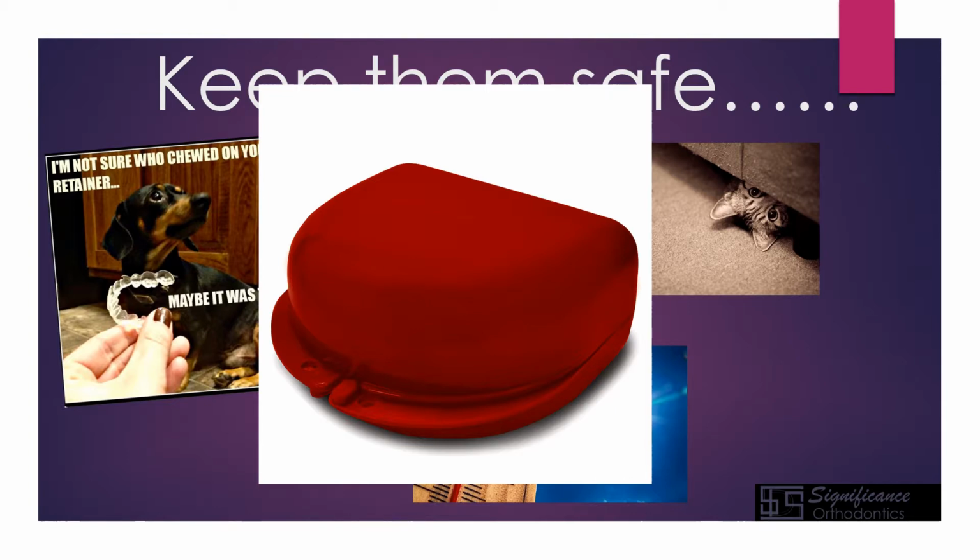That's where they go. So if they're not in your mouth, they're going to be in the case. Do not wrap them in a napkin, throw them in a backpack, or throw them in your purse. They will be gone. You'll never find them again. And unless you're on one of our membership programs that offer unlimited amounts of retainers or up to 4 sets of retainers, you'll end up having to pay for multiple sets. Please be careful with that.